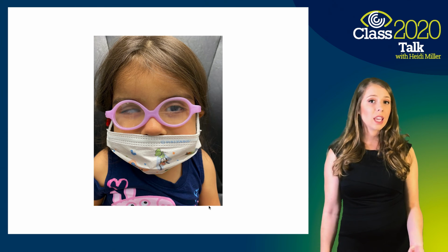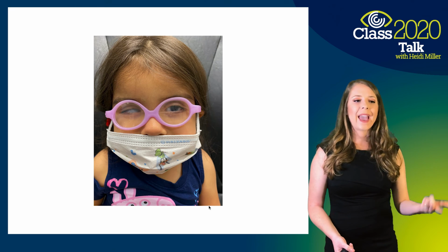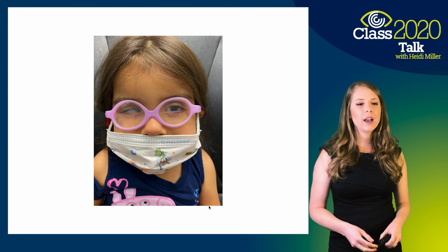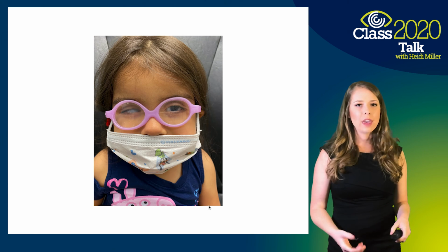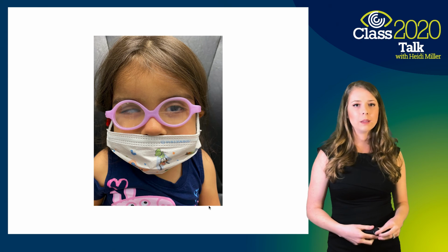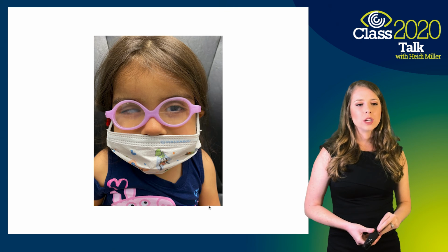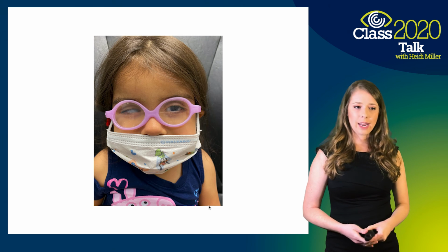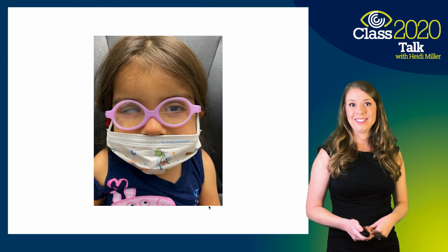Now, she is phakic in her eye. The reason we have that bifocal for her is because of the low vision aspect that she'll have. We just wanted to magnify things for up close with her a little bit because of that vision. But she's doing great. She loves wearing her glasses. She loves wearing her contacts. She loves coming to the eye doctor.